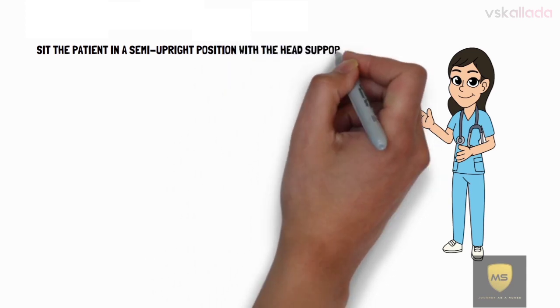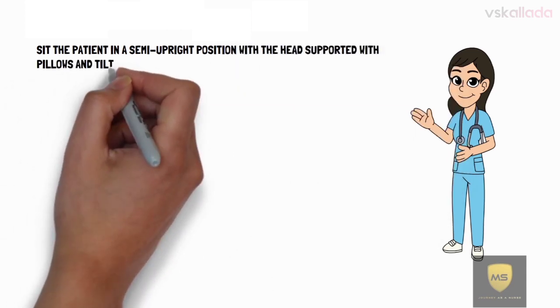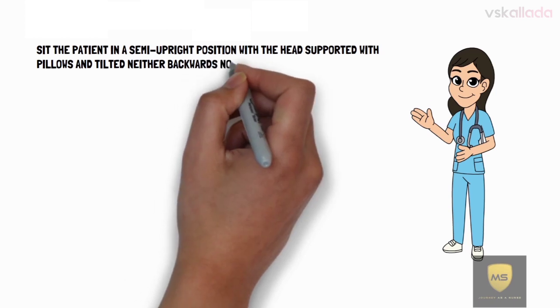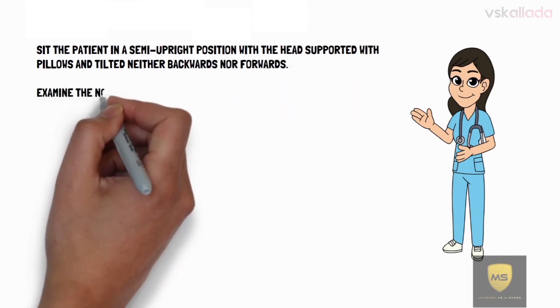Now we can move to the procedure. Sit the patient in a semi-upright position with the head supported with pillows, with the neck neither tilted backwards nor forwards.